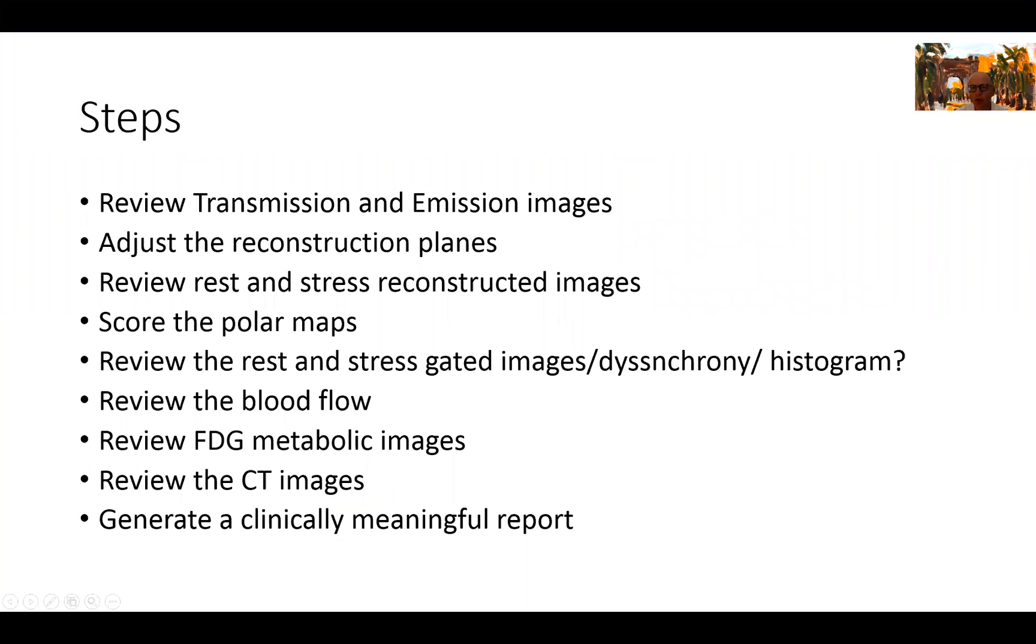So again, we go through the same steps, the same recipe to a successful read of a cardiac PET scan, starting with reviewing the transmission and emission images after you acquire the images and going through all these logical steps and ending up with a clinically meaningful report that we can take back to our providers or the requesting physician.